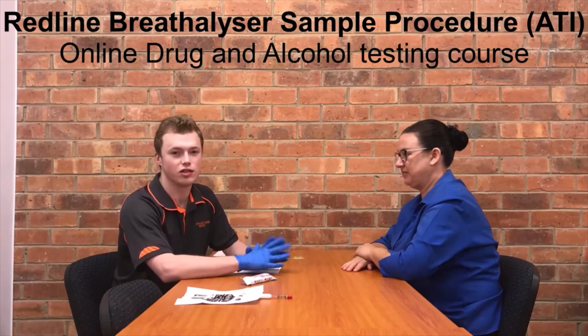Guys, this is just an instructional video on how to do the Redline Breathalyser test, which is one of the tests you'll need to do for your drug and alcohol practical. So first things first, preparing the area. I've got my documentation here, obviously the breathalyzer test, and I've got Kim's 2 forms of ID as well.